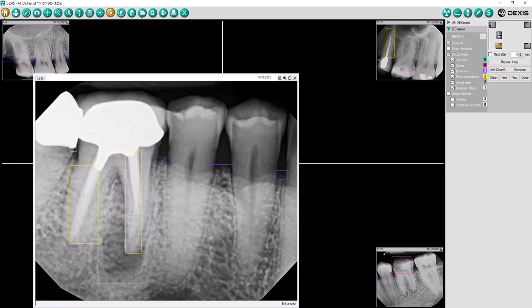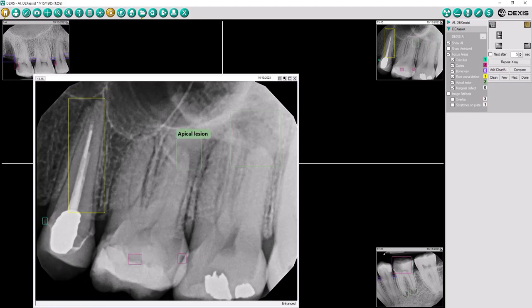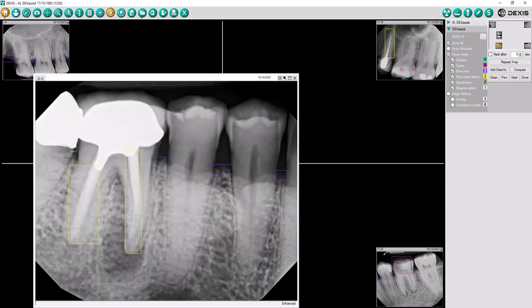DexAssist solution enables users to identify six different dental pathologies: calculus, caries, root canal defects, periapical radiolucencies, bone loss, and discrepancies at margins on existing restorations.